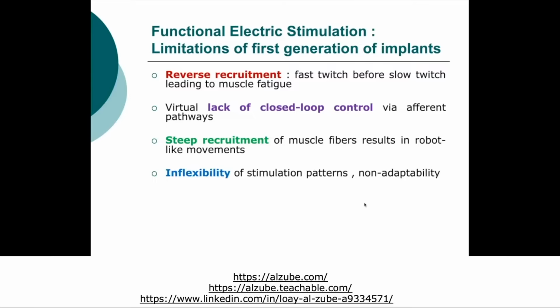recruitment. Also, we have what we call inflexibility of stimulation patterns, which means non-adaptability. So if you want to raise your hand or you walk, you'll be walking or raising your hand the same amount if you are using a functional electrical stimulation solution.